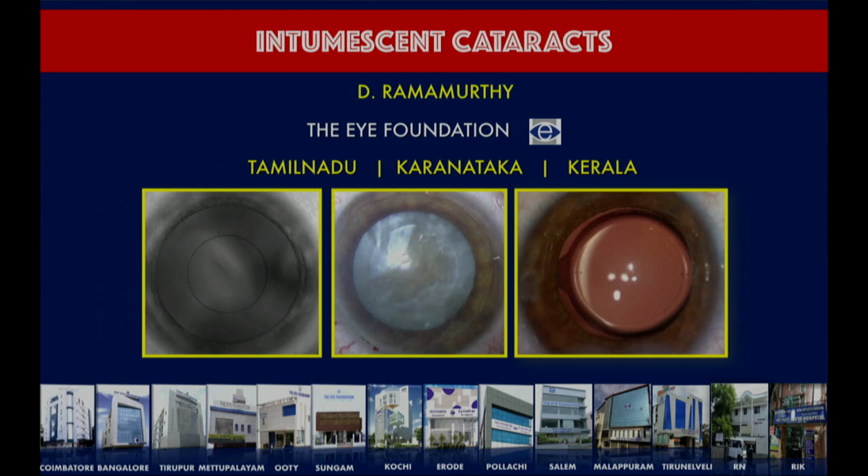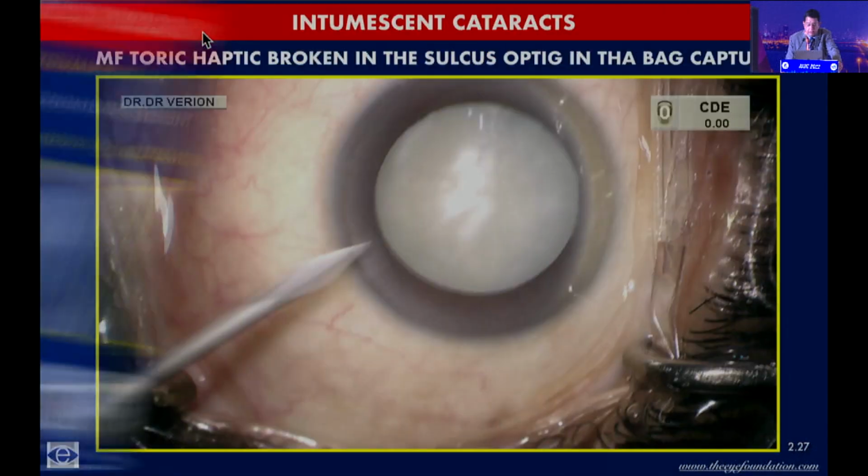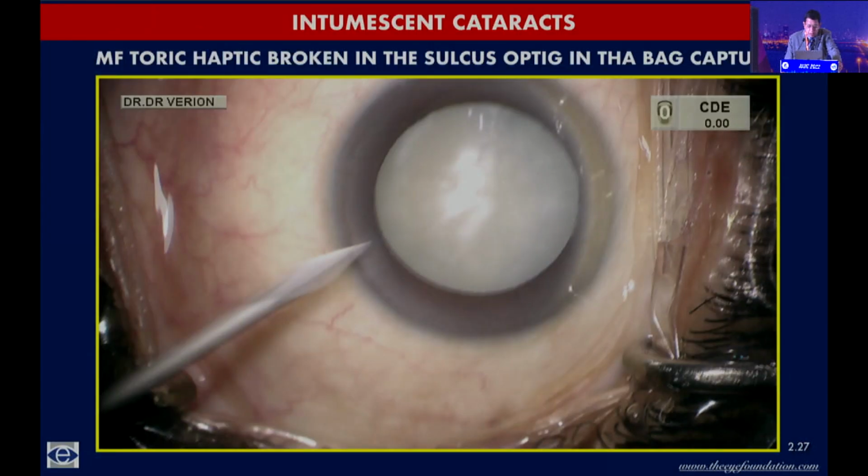Thank you, Professor Titiyal, for having me over here for this wonderful course. It's so nice to be back in circulation with so many faces unmasked, and I really look forward to these times lasting forever. The topic given to me by Professor Titiyal is intumescent cataracts. And let me start off with one typical case.